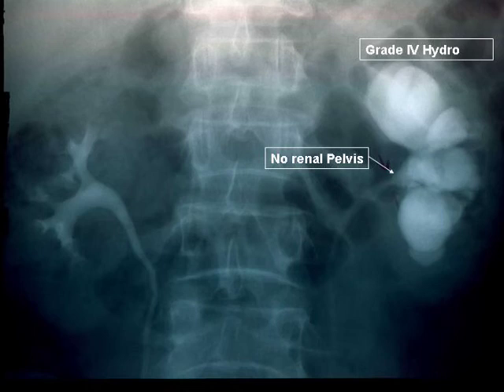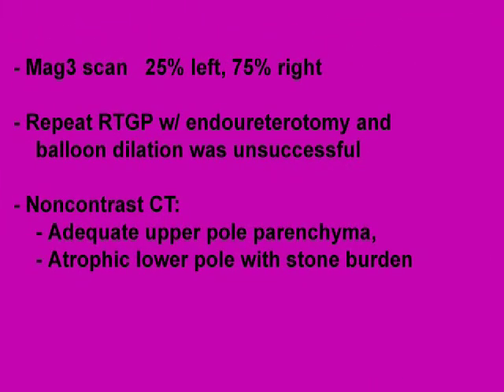Notice the diminutive renal pelvis and the significant obstruction. At that time, his renal scan showed 25% function of the left kidney. A retrograde was performed and an attempted endoureterotomy was performed with balloon dilation.